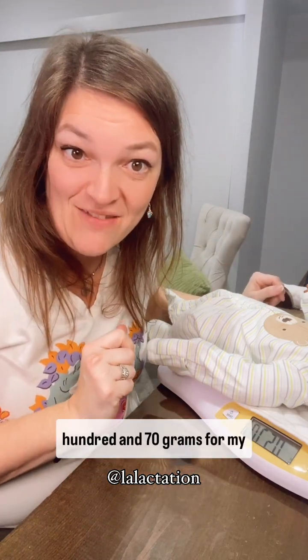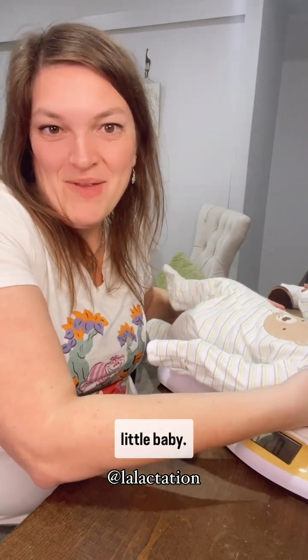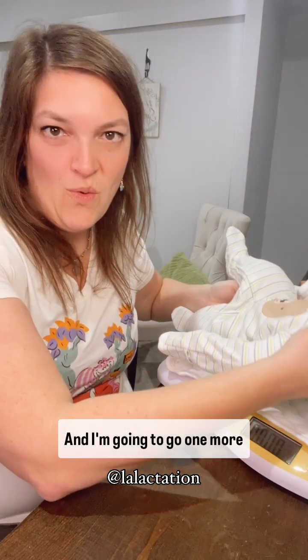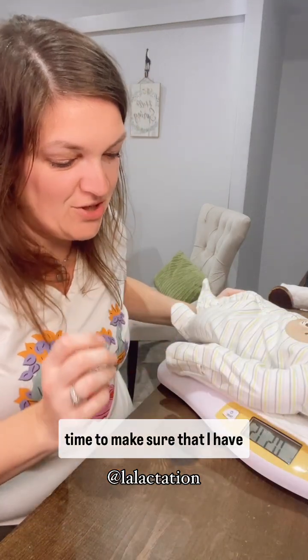Right now this is 570 grams for my little baby. So I'm going to take my baby off, tare it, and go one more time to make sure that I have 570 grams.